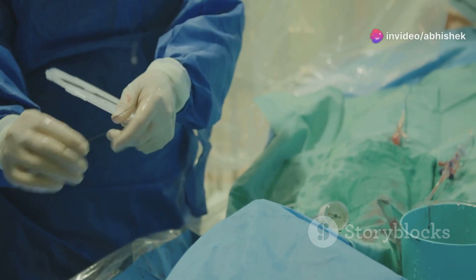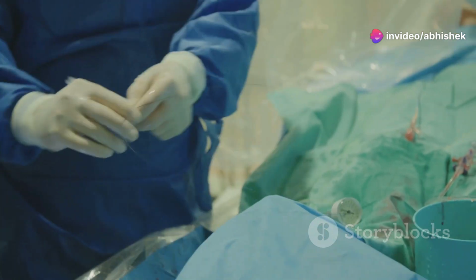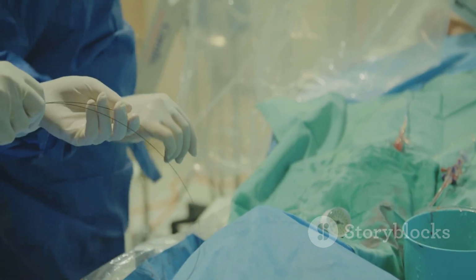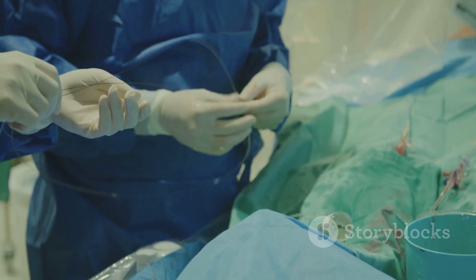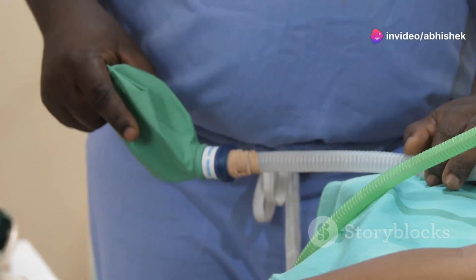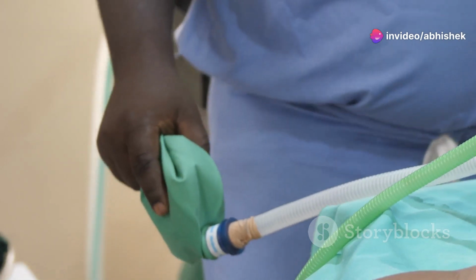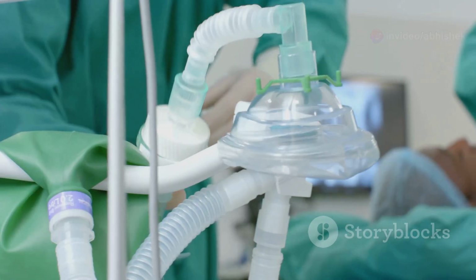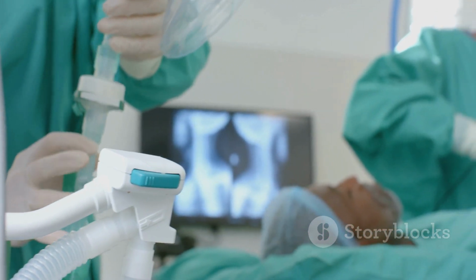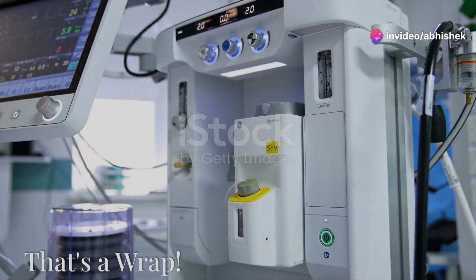It uses a vacuum to remove saliva, blood, vomit, or any other fluids that might obstruct the airway. We use a sterile suction catheter, a thin tube connected to the suction machine, to clear the airway and ensure the patient can breathe freely. Maintaining a clear airway is crucial for patient safety during surgery, and the suction system plays a vital role in achieving that goal. It's another example of how the anesthesia machine is designed to handle a wide range of situations and keep the patient safe and comfortable.